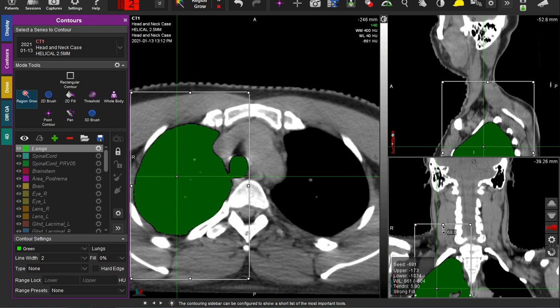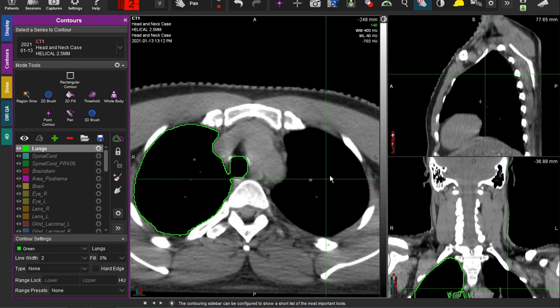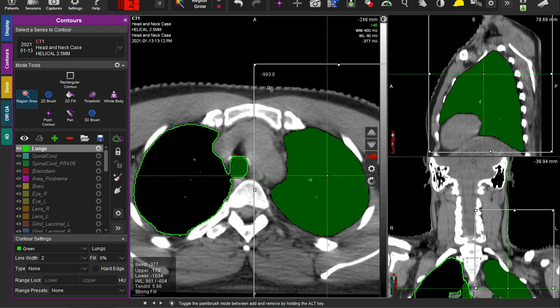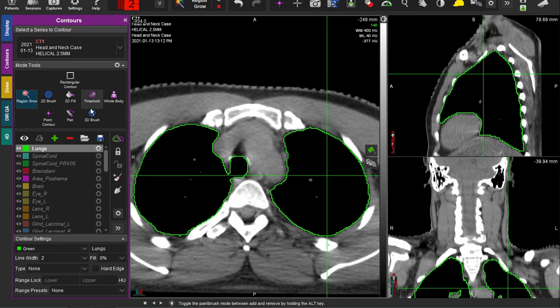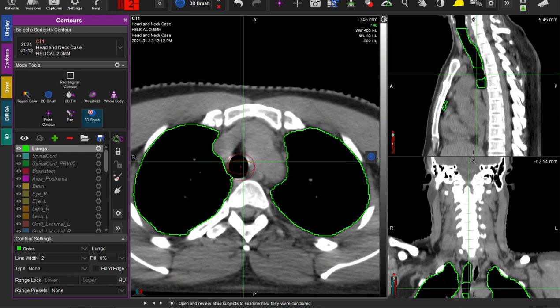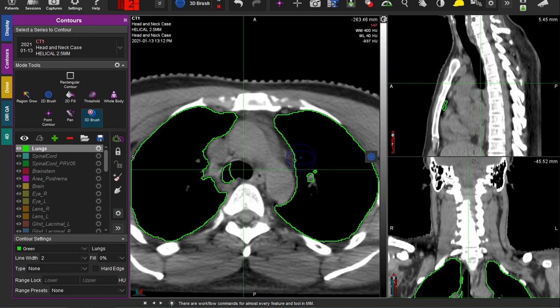We'll begin with the lungs. I'm going to do a region grow here, looking at my sagittal and coronal to make sure I'm in the right box. Then we will do the contralateral lung. Lung is important to contour if you're getting down into the level 4 lymph nodes for your involved or elective nodal CTVs, so you can calculate an accurate mean lung dose distribution. For this reason we scan down to the diaphragm, not just to the top of the lungs.